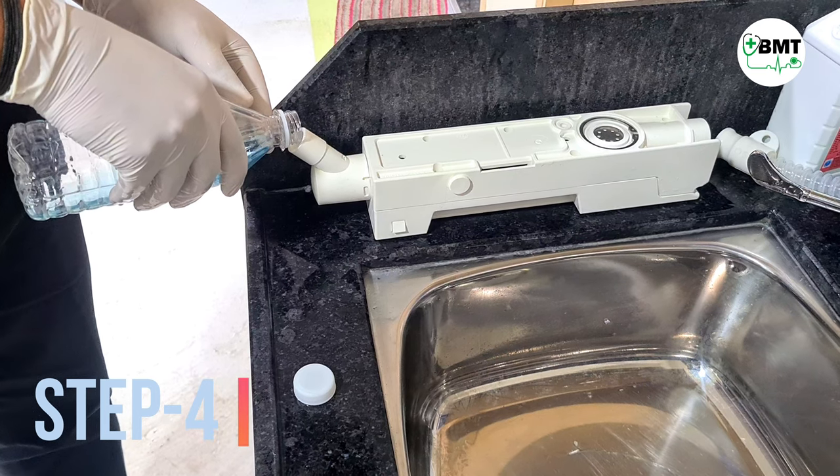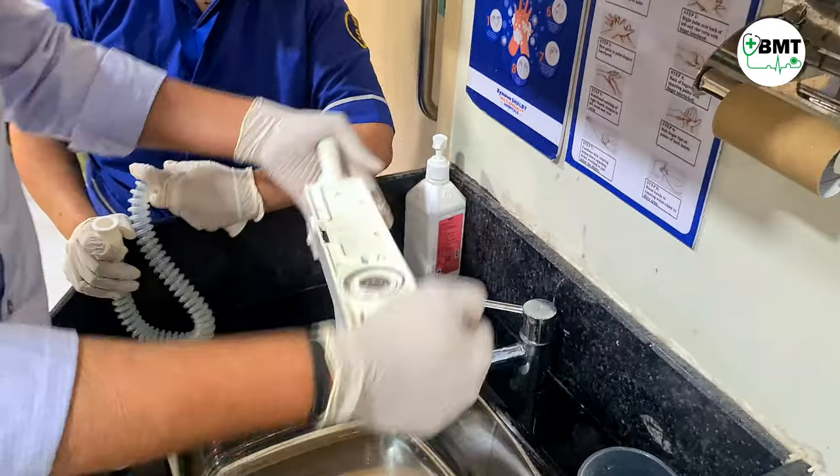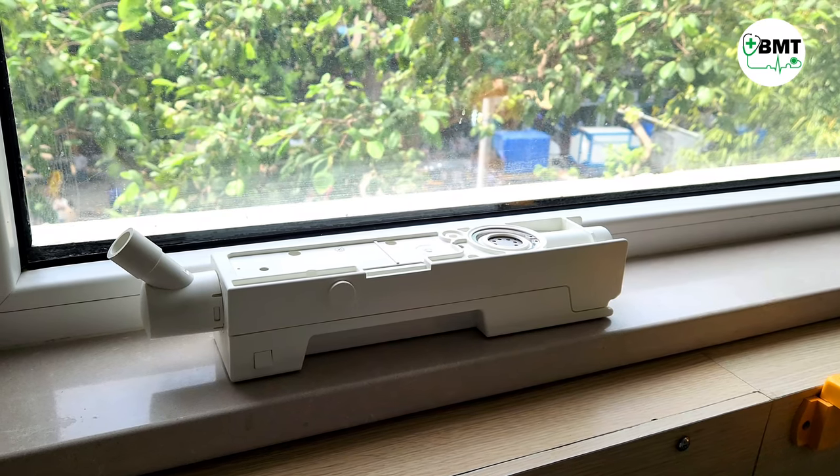Step 4. Take 75 ml of cidex solution and refill it in the expiratory cassette. Rinse it properly and then keep it aside for 30 minutes.